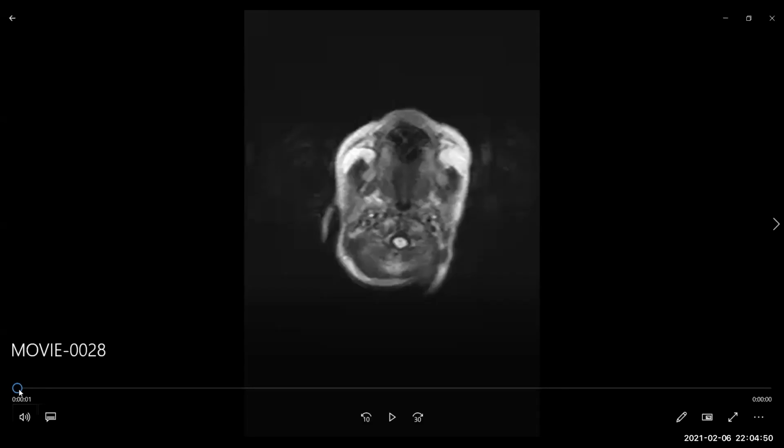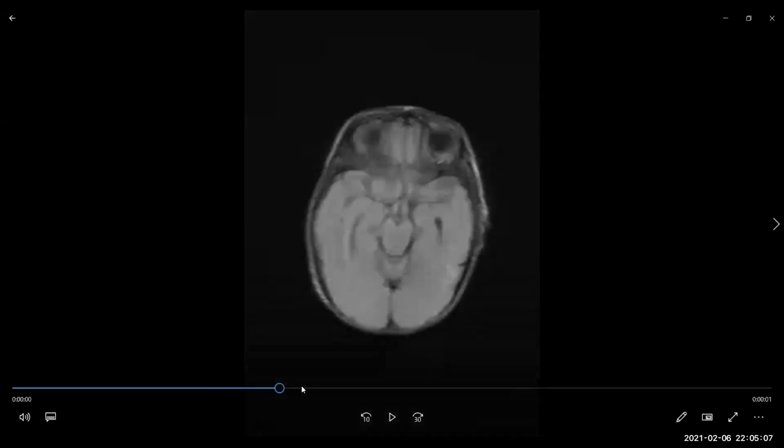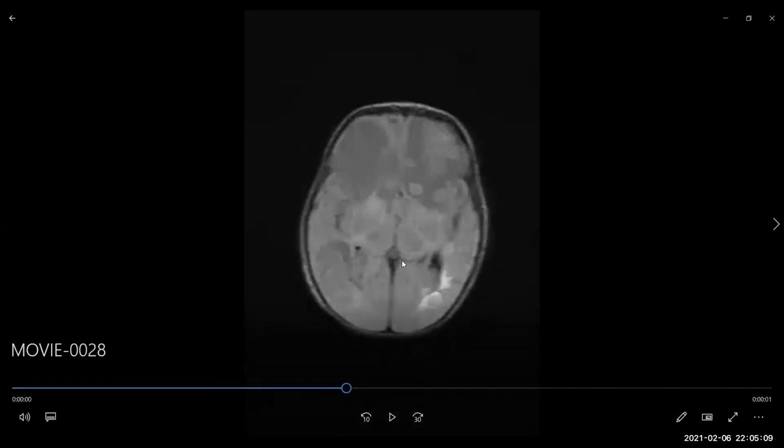Okay. So here again, an unconscious patient presented in the emergency department.